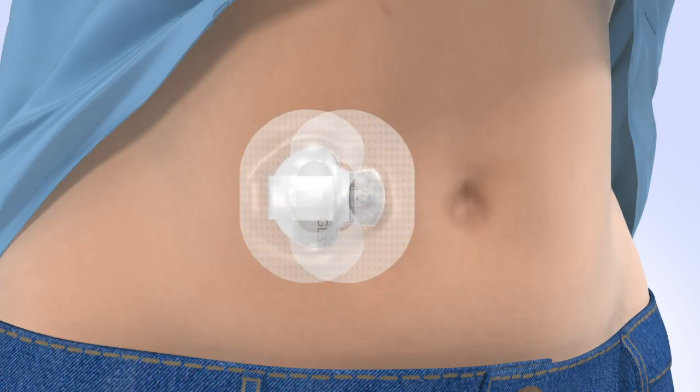As you wear your sensor, be sure to regularly check your site. If additional tape is needed to secure the sensor and transmitter, you can apply additional tape.